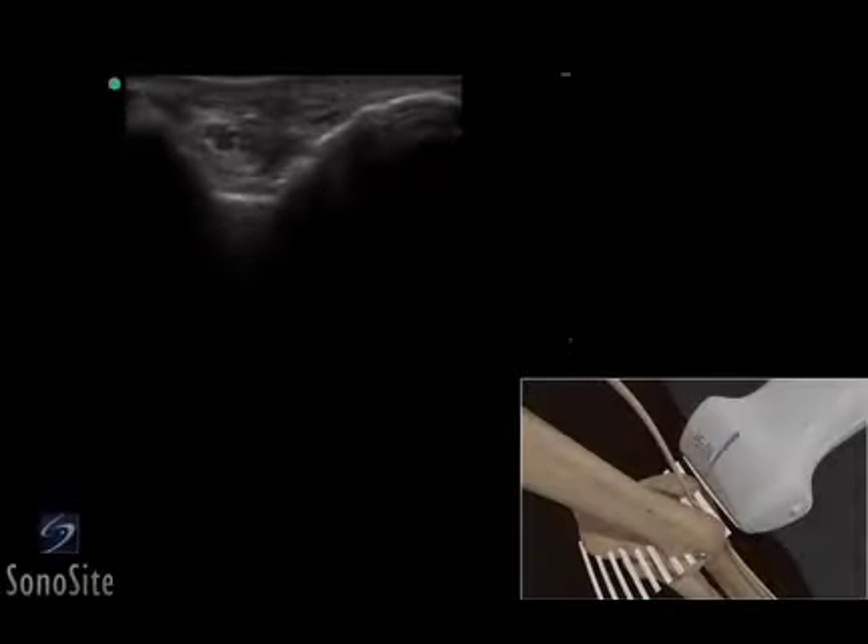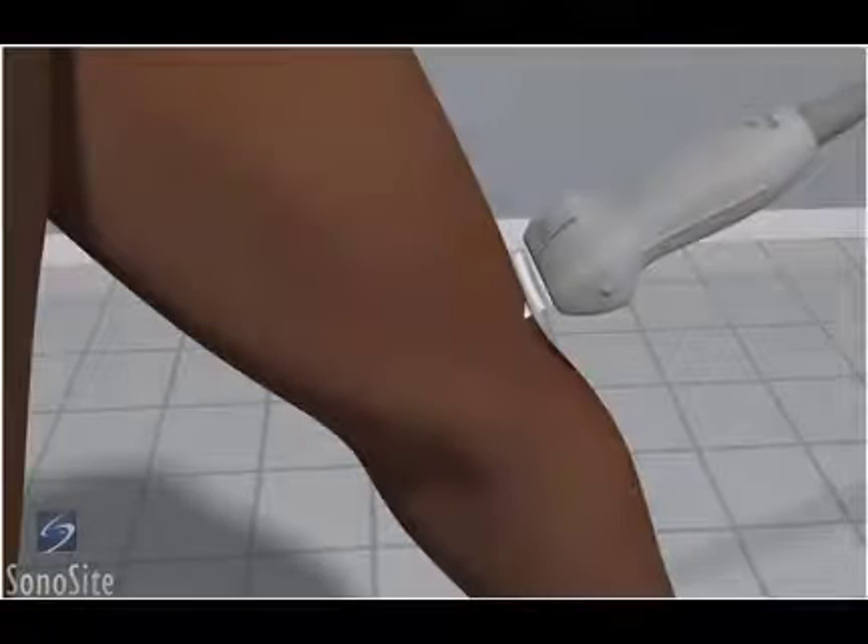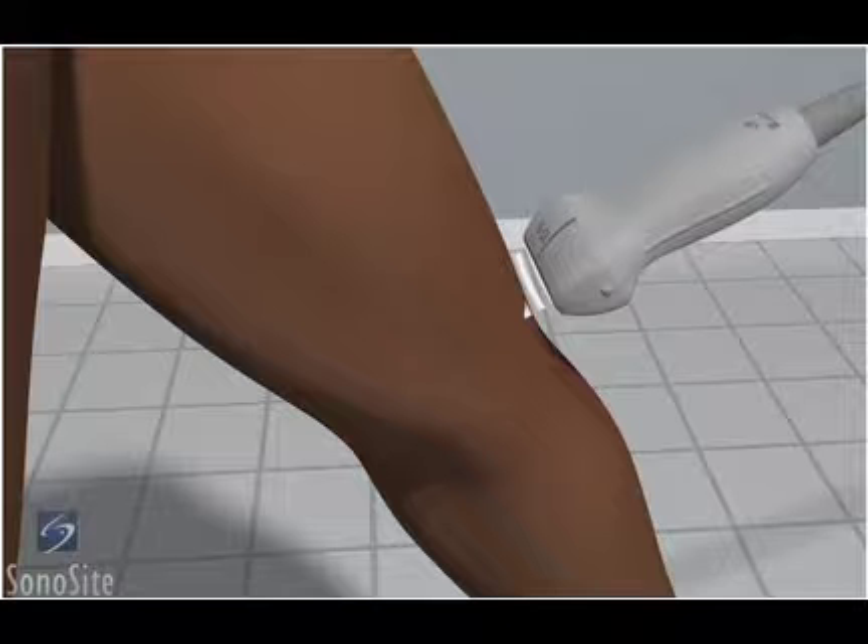A linear array transducer with a musculoskeletal exam type is used to perform an ultrasound examination of the cubital tunnel. The patient's elbow is placed in forceful internal rotation with the elbow in full extension.